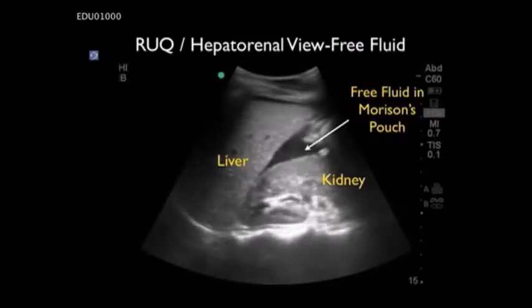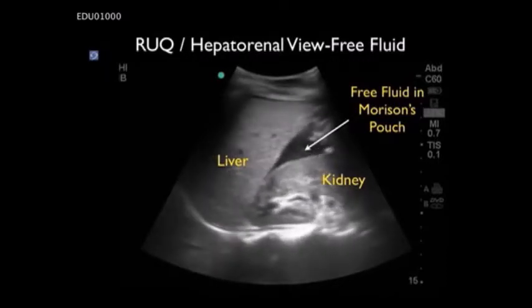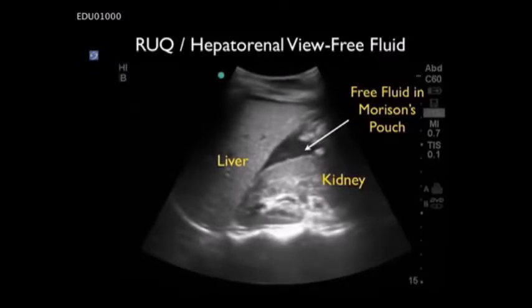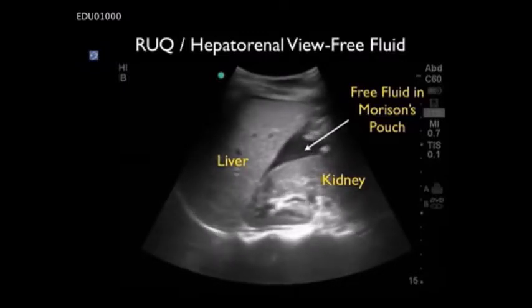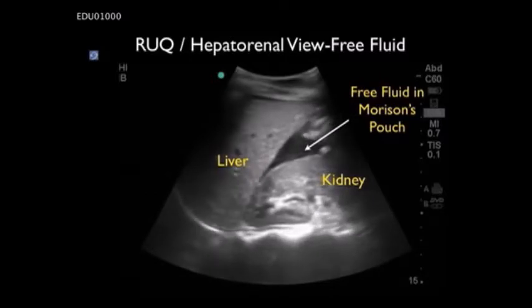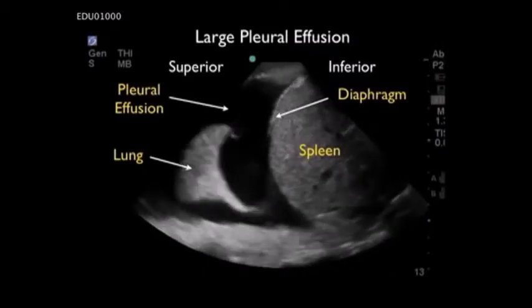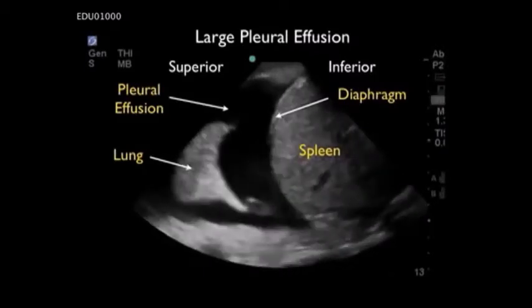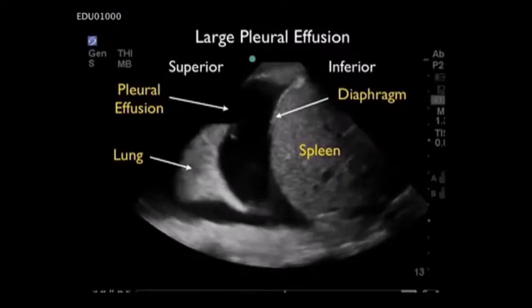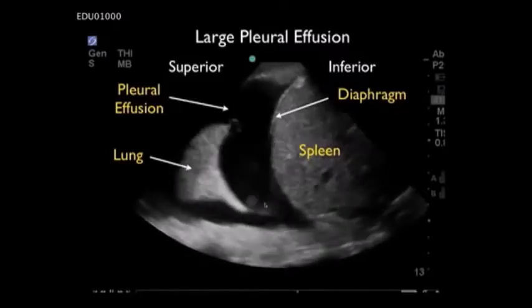Now, in the non-trauma patient, this could indicate failure of the heart, liver, or kidneys as contributing pathology to the patient's physiological state. Now, in the patient with a fever in this finding, this could indicate the possibility of spontaneous bacterial peritonitis and the need for paracentesis to obtain cultures of the fluid. By angling the ultrasound probe above the right upper quadrant and left upper quadrant views, we can actually look above the diaphragm to look for the presence of positive free fluid within the thoracic cavities.